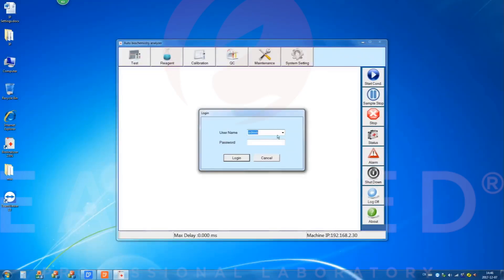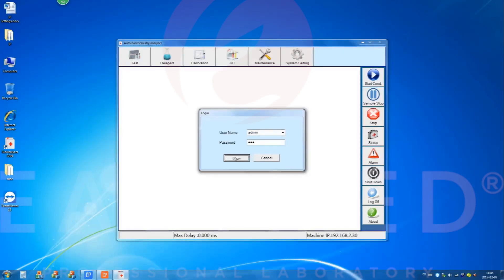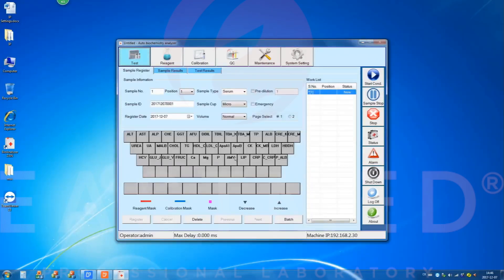Select the default administrator account, input the username 'admin' and password '123', then click the login button to log in.